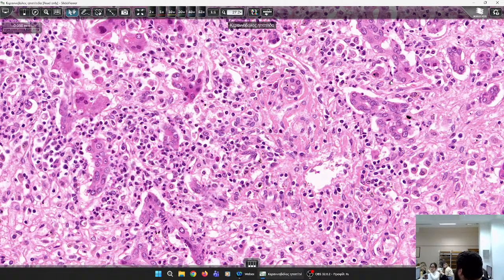Toxic substances. And when you want to identify what caused that, in this setting they don't wait for the histopathologist, because they know whether she took acetaminophen or did nothing, so probably she has high IgG levels, so it's probably autoimmune. But there are still signs.